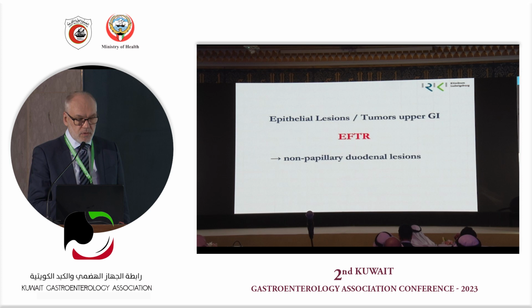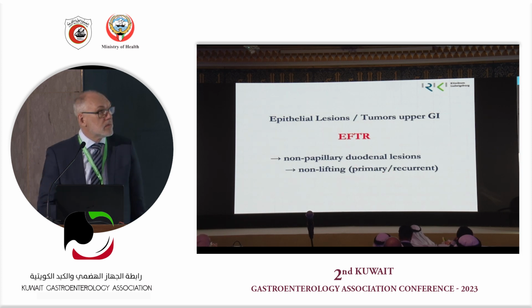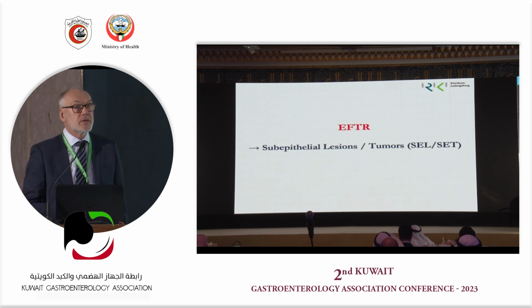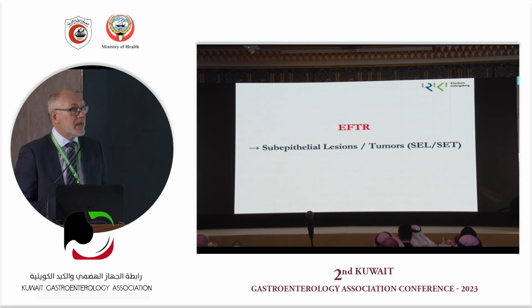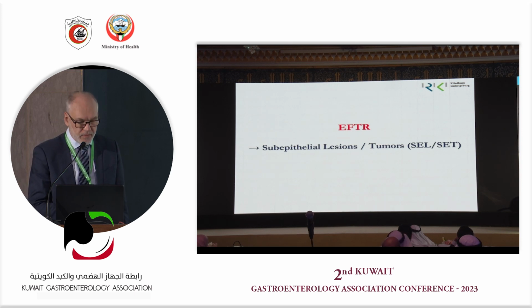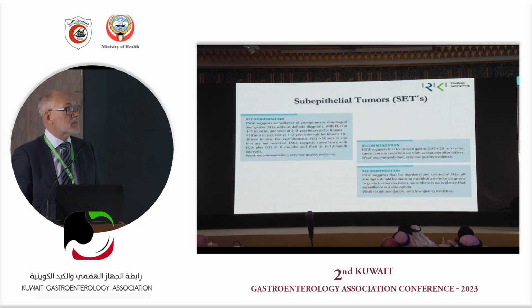We're not going to use it in the esophagus, and we will use it for non-lifting primary or recurrent adenomas in the duodenum. Other story with subepithelial lesions: if we are treating them, we naturally have to do a full thickness resection, an EFTR, otherwise we are not going to be able to take them out.